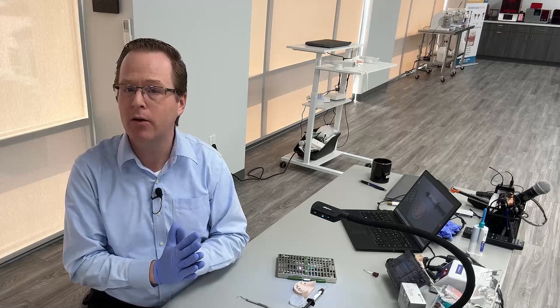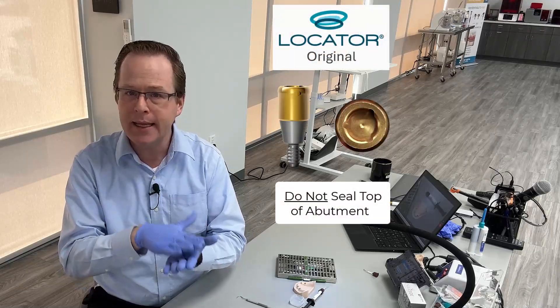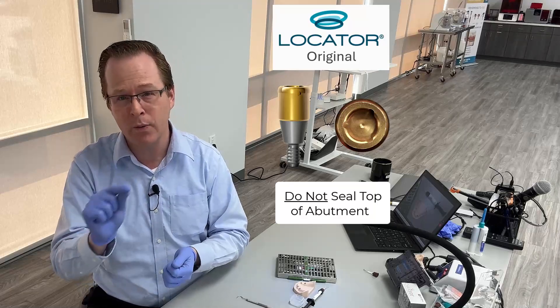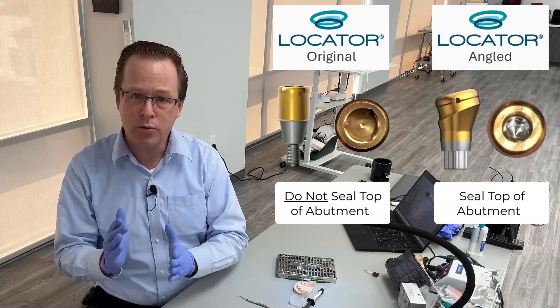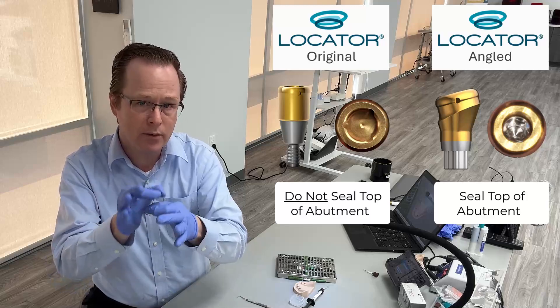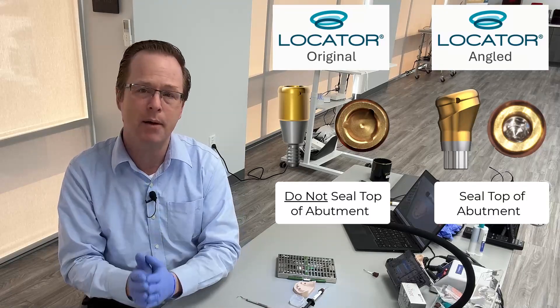Now, understand that up to this point with our traditional locator abutments, we've advised that you do not want to go ahead and put anything on the inside of your traditional locator abutments — the one with the little triangle, the gold in the triangle. Now, with our locator angled abutments, we do advise that you need to go ahead and seal the top of the little channel.